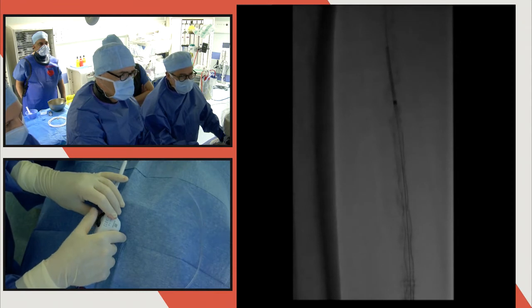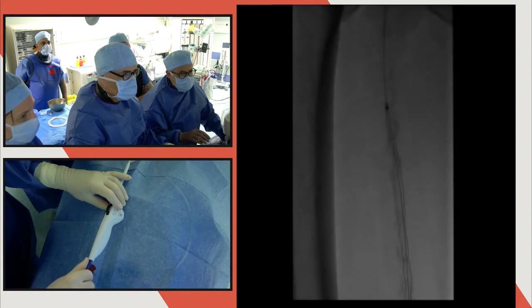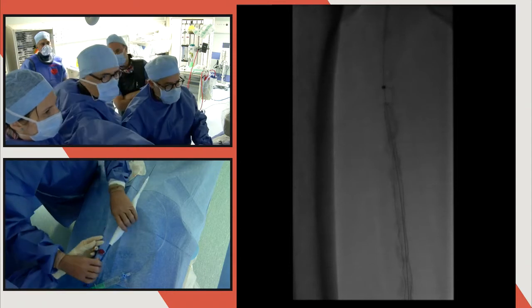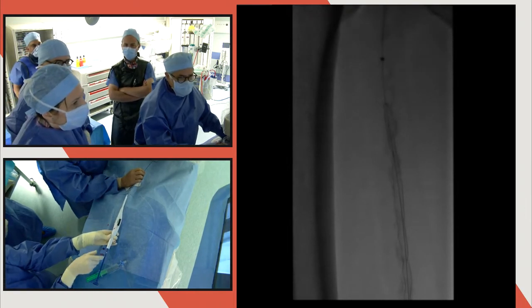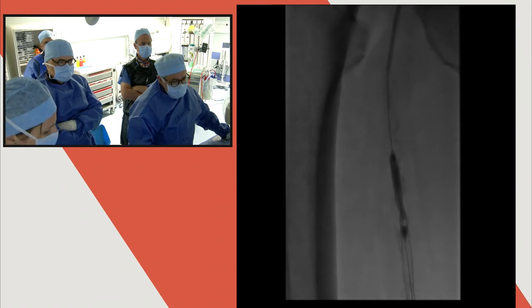We will need another stent. Right at the lesion, the severe stenosis over here. So 4 centimeter additional stent. What was the length of this? 150. Okay. It's 5 millimeter by 4. 40, 15, 20.